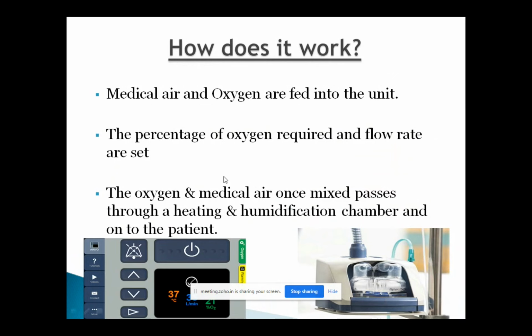So what we do, we set the flow to 30 or 35 liters, and then we give extra oxygen on the side of the machine. You can see in the second picture, a little green tube is the oxygen you're giving. If you don't give any oxygen, the patient will be achieving the room air oxygen concentration, which will be 21%. By feeding extra oxygen into the unit, the FiO2 automatically goes up.